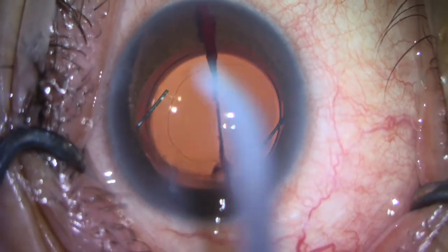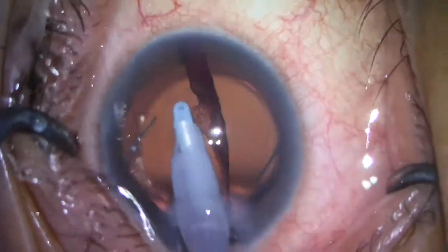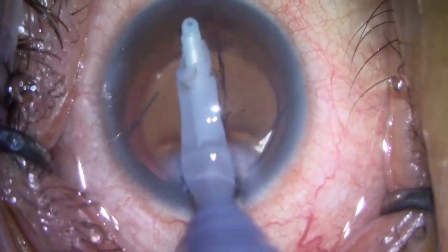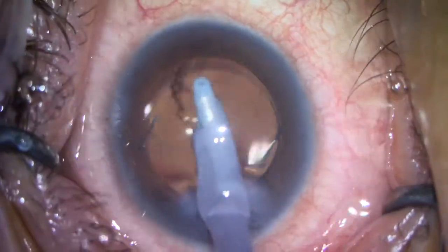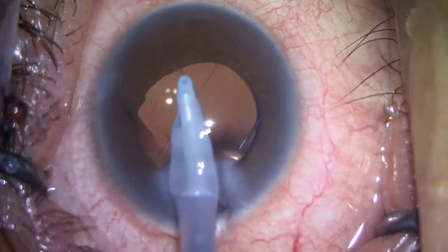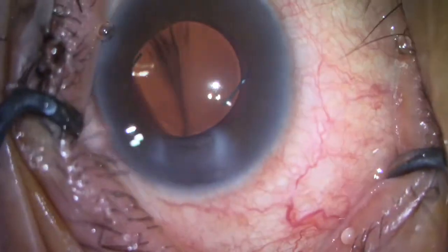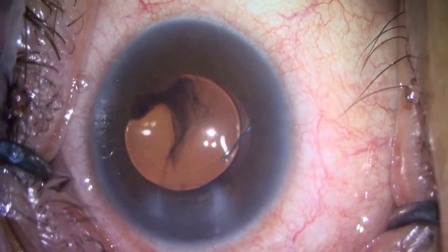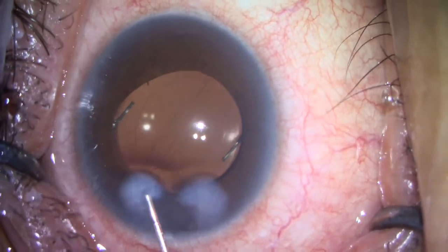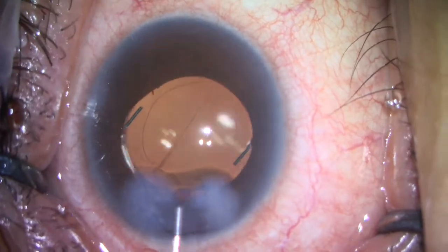You can see some blood extruding from the lumen of the Cypass. This was essentially perfect placement. I then go in and take out all of my Helon GV. You will see that this blood coming from the Cypass is aspirated out of the eye. When the eye is soft, you can see a small amount of additional heme that will continue to flow from the Cypass. As I remove my handpiece, you can see some blood that continues to extrude. I then pressurize the eye using balanced salt solution and irrigation of the wound. You can see this heme completely stops.